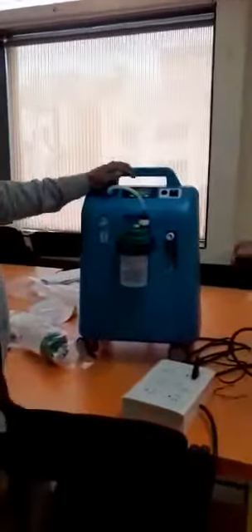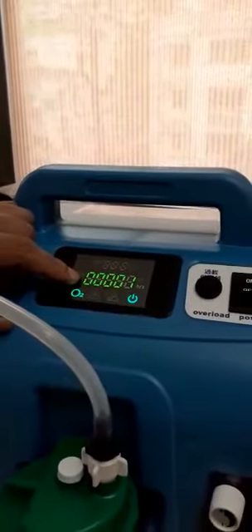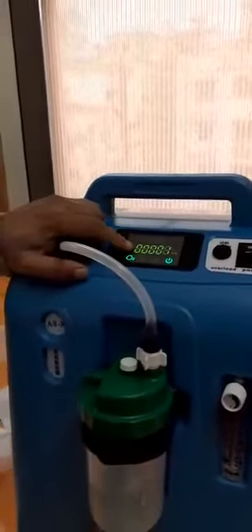There is one important thing I have missed — the numbers on the digital display. This is the number of hours on which your filter has worked. The filter life is 5000 hours, and after 5000 hours you have to change the filter.